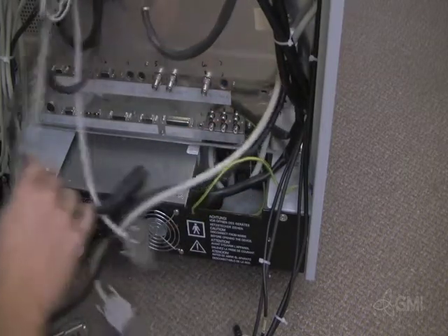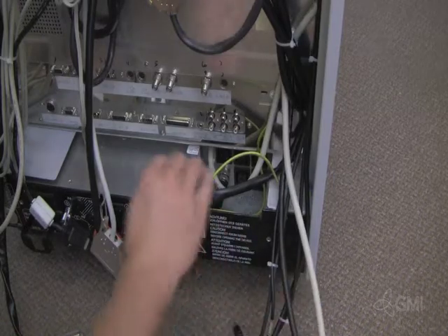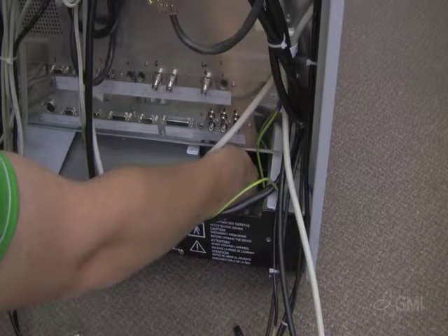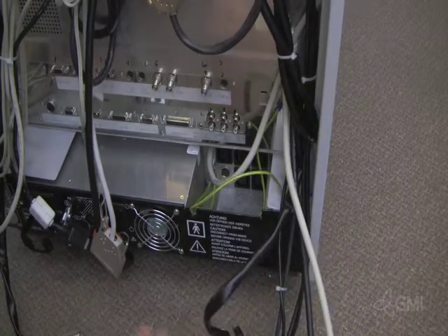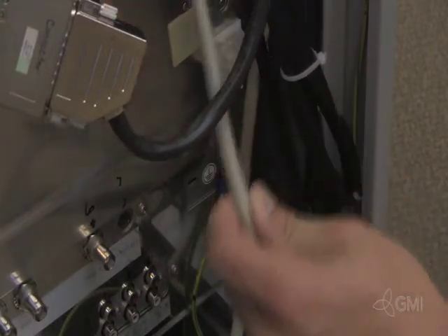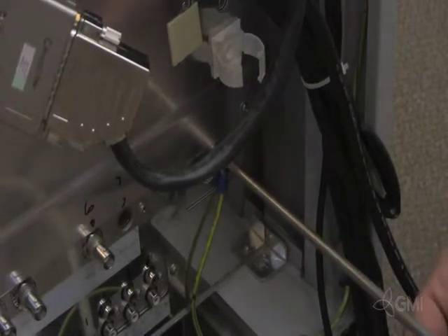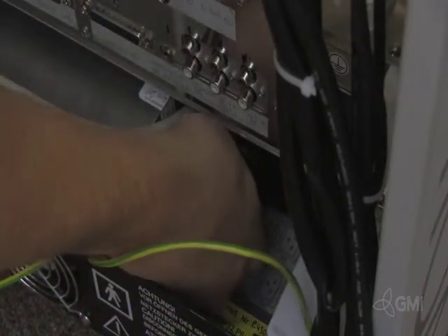Unplug all power cables from the main power supply. Remove the ground cable from the e-box assembly. Remove the ground cables from the main power supply.